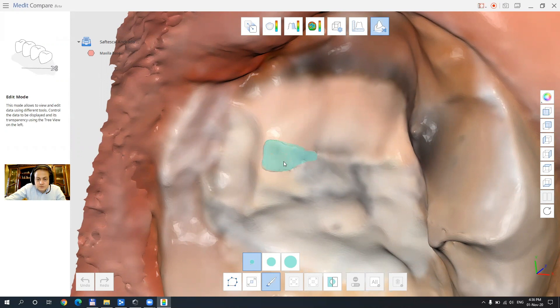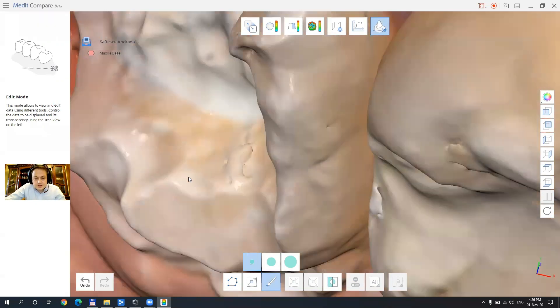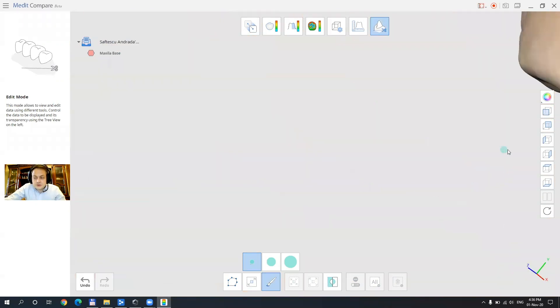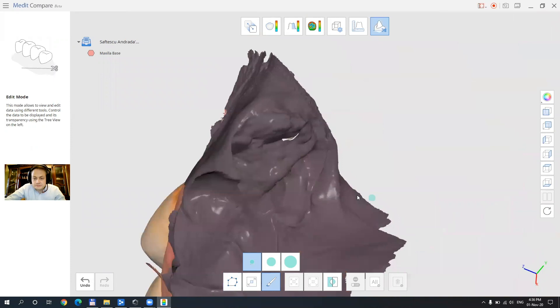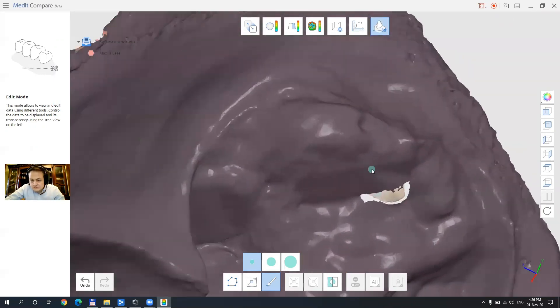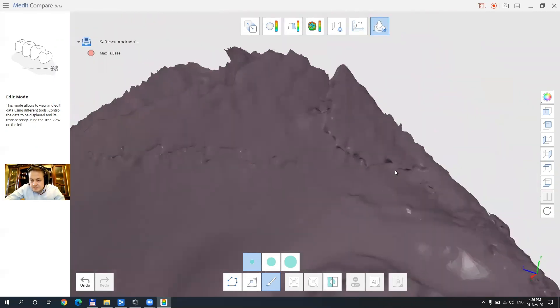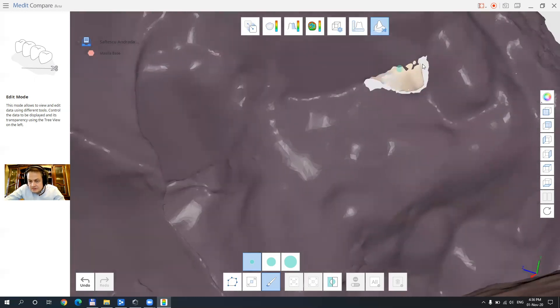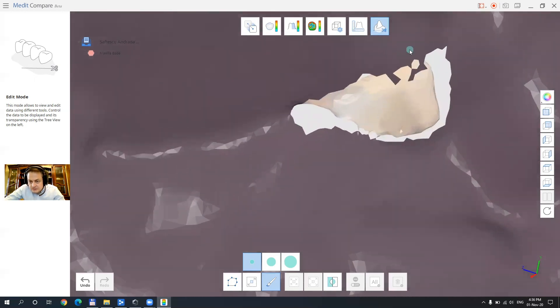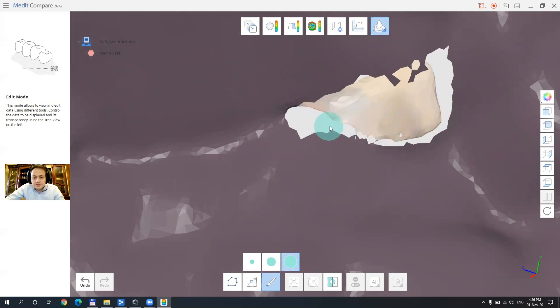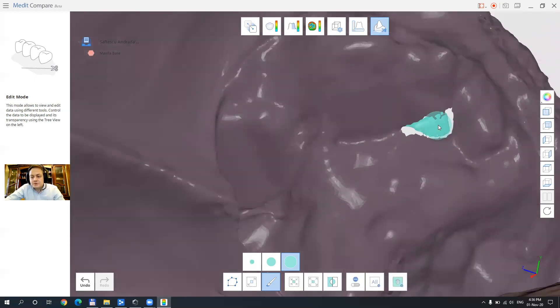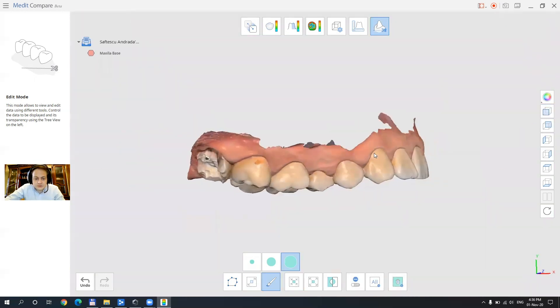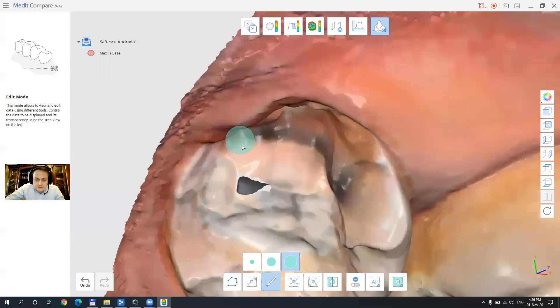And we will remove this and now we're gonna go straight on the other part of the model and remove that little part as well. Being with a mesh flipped you're only going to be able to select what faces you so it's very easy to do this. You just don't need to worry that you're gonna select anything else. And as you can see here nothing got selected and now we'll just delete the floating part.